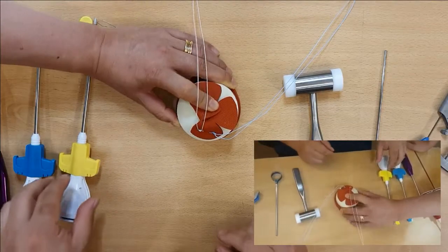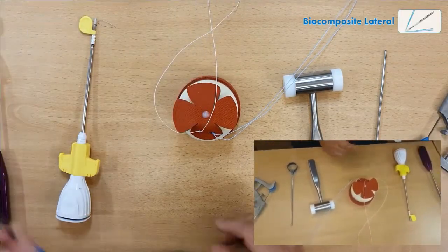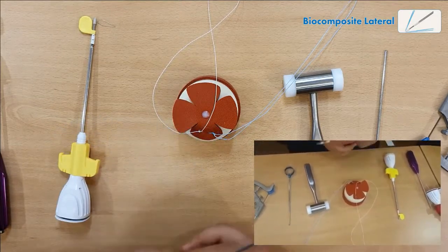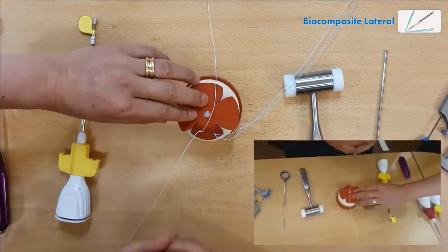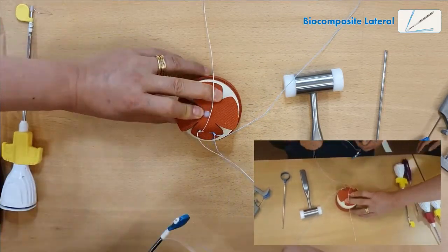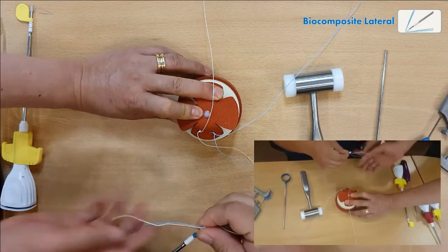Now, I'm going to use the biocomposite lateral anchor. Just pass one of the strands from the fiber wires that you passed on the medial wall, just pass it through the eyelet.